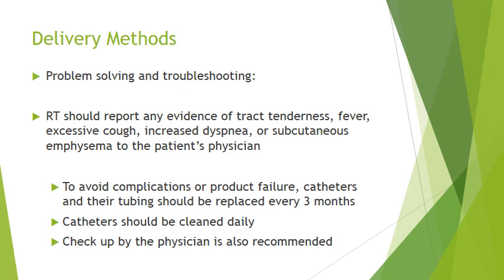To avoid complications or product failure, catheters and their tubing, like I had said before, should be replaced every 3 months. And these catheters should be cleaned daily, of course, to prevent infection and other problems. And it's very important that the patient is checked by the physician regularly for any other things that they may not even realize is going on. So they need to follow up with their doctor just for ongoing care.